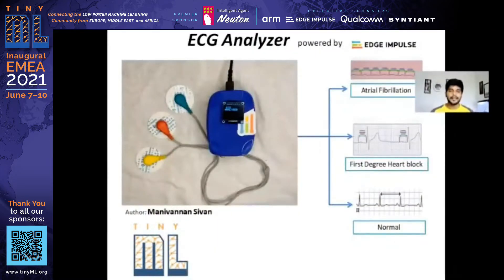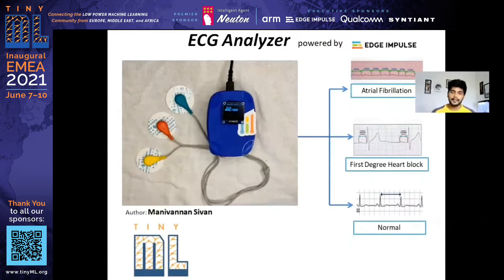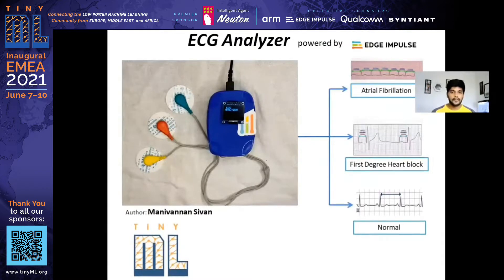I have developed an ECG analyzer device based on a TinyML application using Edge Impulse software. This device can detect atrial fibrillation, AV block, and also a normal case. For this project, I have used an Arduino Nano 33 BLE Sense.